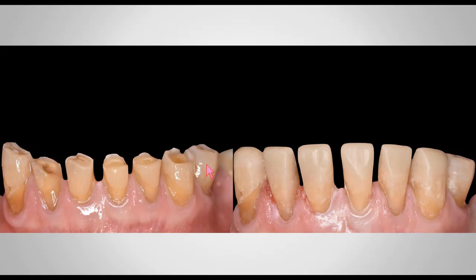So what we did is that we did the whole 9 yards. We go ahead, we make the cast. We use a 20-degree template, and we decide where that new incisal edge position is going to be located. Once we know that, we add wax to the cast, and we localize the incisal edge in its new position using that 20-degree template.